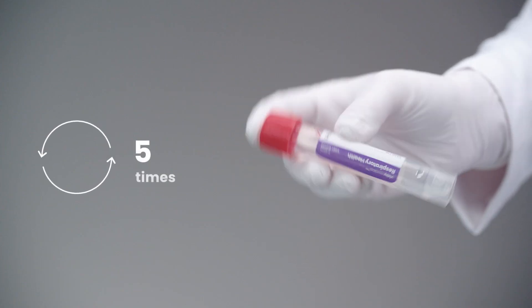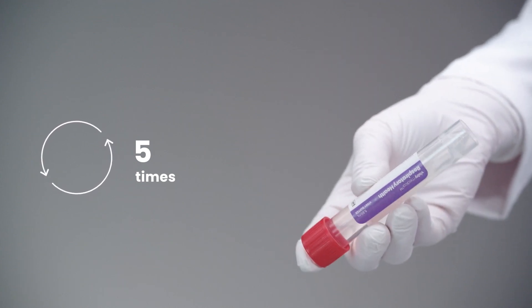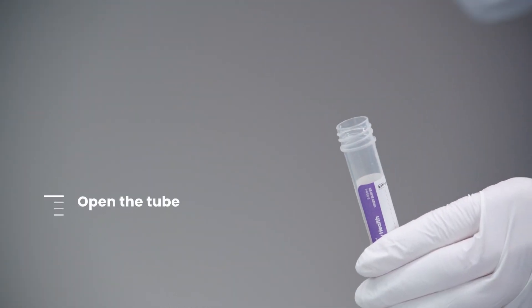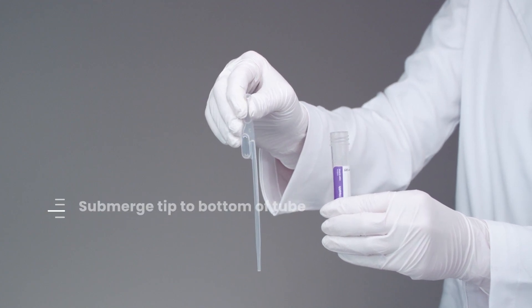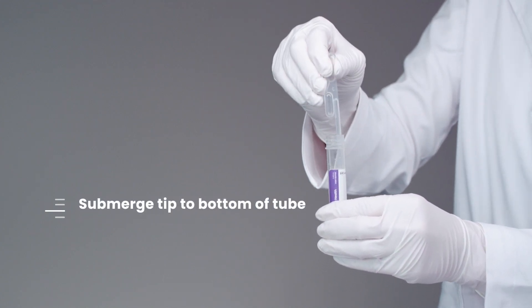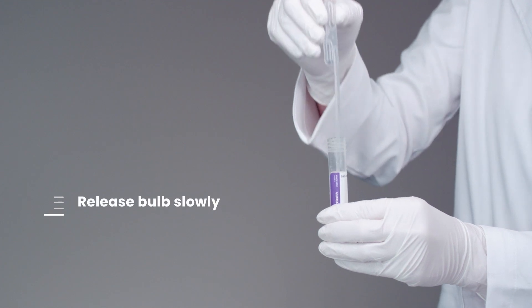Gently invert the patient sample five times to mix. Open the tube. Squeeze the upper bulb of the pipette and submerge the tip to the bottom of the tube. Release the upper bulb slowly to collect the fluid.